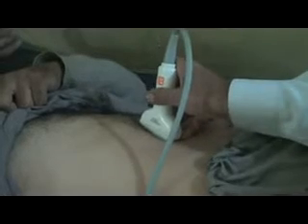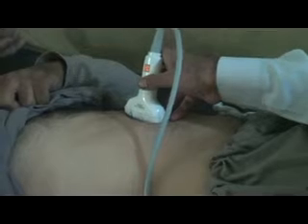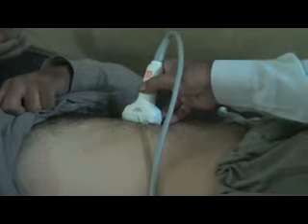Here you have to place it at the upper third. In some patients you may have to come down in line with the subcostal region, but normally to see the gallbladder in this view, it's better to place the probe here and in line with the intercostal space.